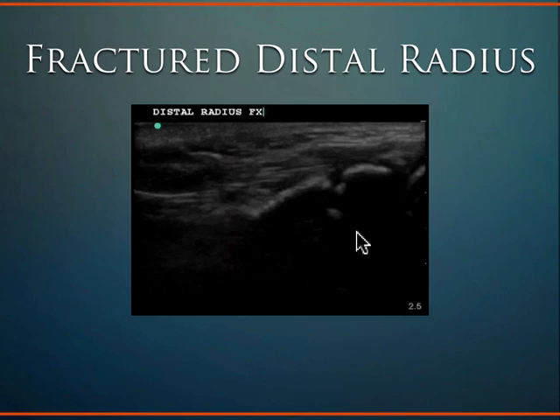So when you're doing an ultrasound, you put so much gel on it. You can get gel out of the refrigerator. I always keep the bottle in the refrigerator, and so you can put some chilled gel on there, and then you don't even touch the skin. The ultrasound touches the gel, and then it's actually painless to do an ultrasound for a fracture, as long as you're not moving the bone. Once you start moving the bones around, then the patient will let you know about it. For sure.